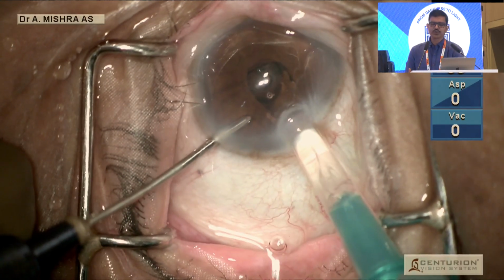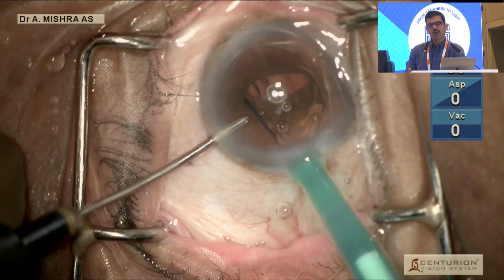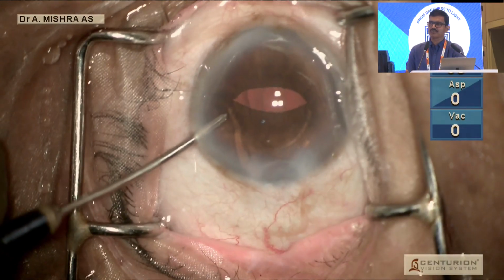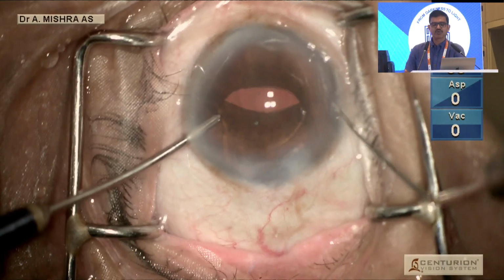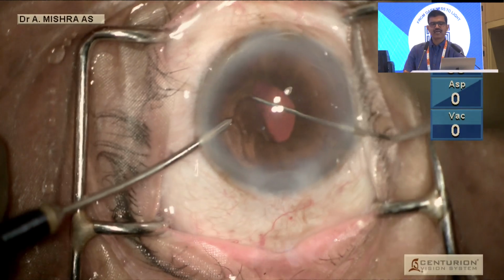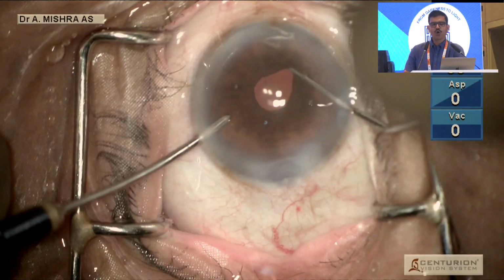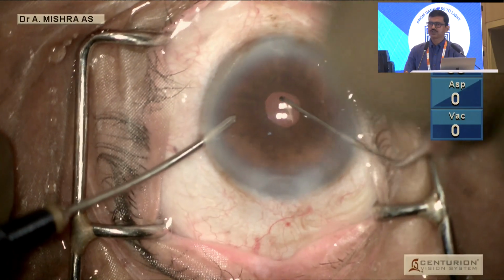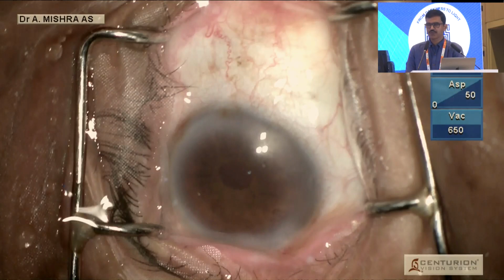The advancing haptic is fed into the bag and then I use the IOL optic to stretch the pupil for some time while the second instrument goes through the other side port. We know that we have a tilted IOL here, half in and half out of the bag. That makes our job easy to dial the remainder of it in, all under cover of BSS. We don't need to use viscoelastic or any pupil expansion devices just to do this job of ours towards the end of the surgery. Thank you so much for your attention.